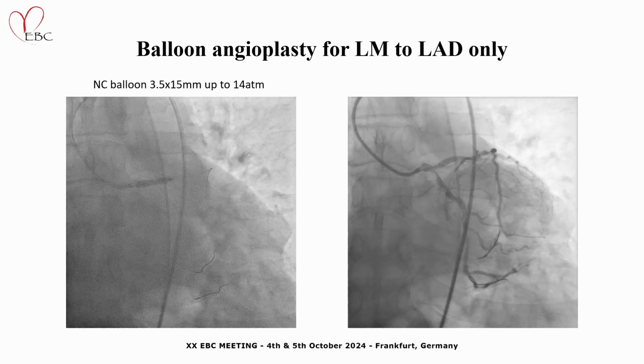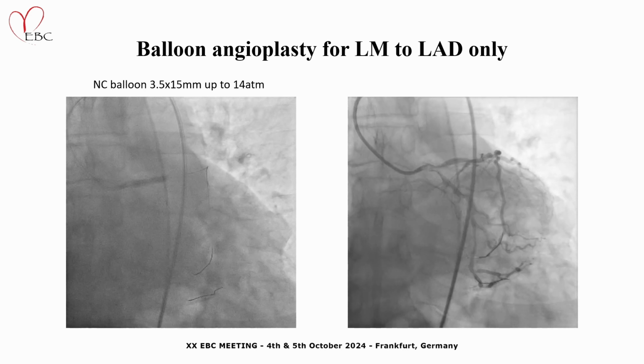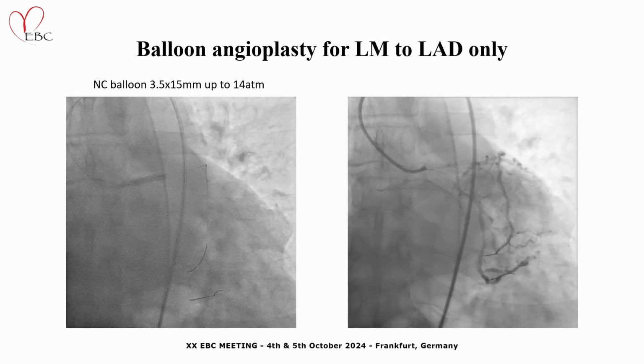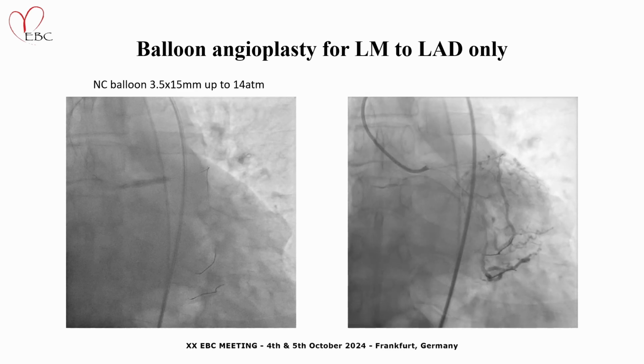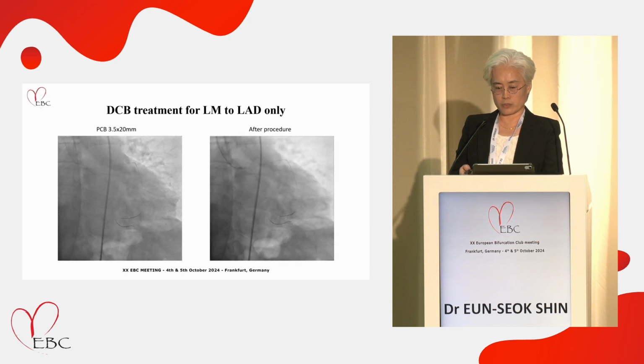Lesion preparation was performed with a pre-dilation balloon sized to match the reference vessel, using a 3.5 millimeter balloon up to 14 atmospheres. The results were satisfactory. The flow was normal in both the circumflex and LAD.